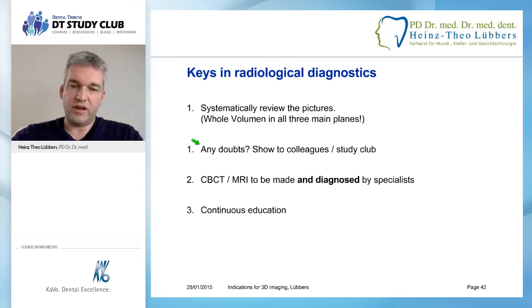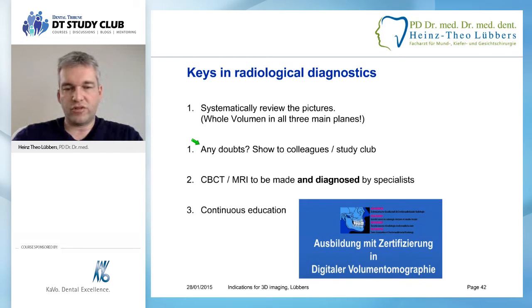And for cone beam CT and MRI, I would recommend to let them be made and diagnosed by some specialist, by someone who sees a lot of those pictures, because otherwise it's very difficult to pick up all the information you could pick up in these images. And the last point, of course, is continuous education. So if you decide to use cone beam CT or to run one by yourself, go for some kind of continuous education, whatever type you like.